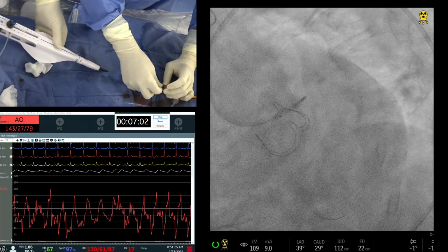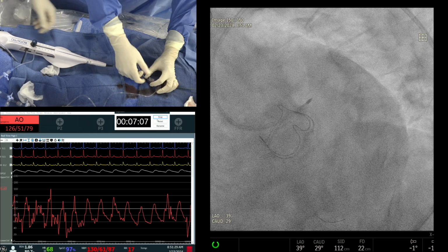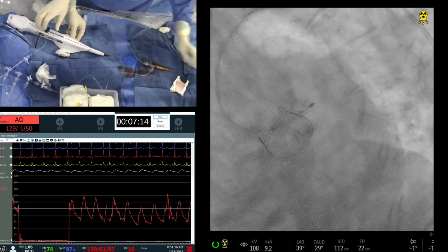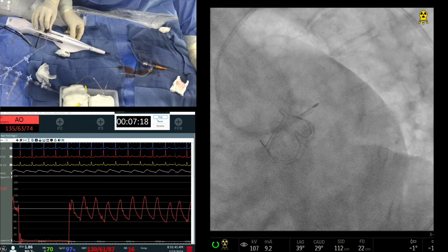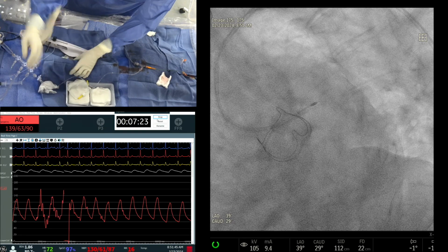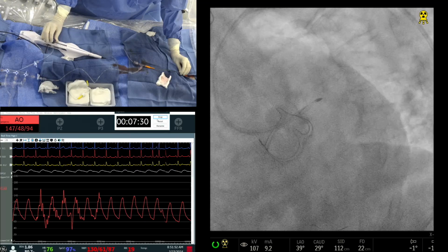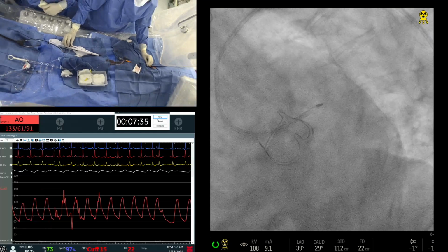Voda Mark 1 guide, and here is the key, that your burr does not jump. So you have to take all the slack out. The tension, yes, and we'll do it probably from the guide itself. Yeah. Okay. So Dynaglide tap first. Good. Okay. Let's start. And the balloon should be ready on the table. So we have a 3.5, 15 balloon ready. 5 seconds. 10 seconds.